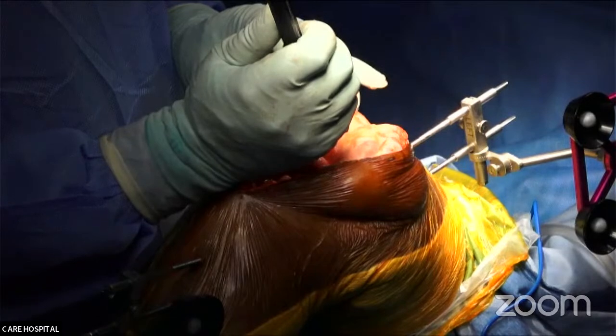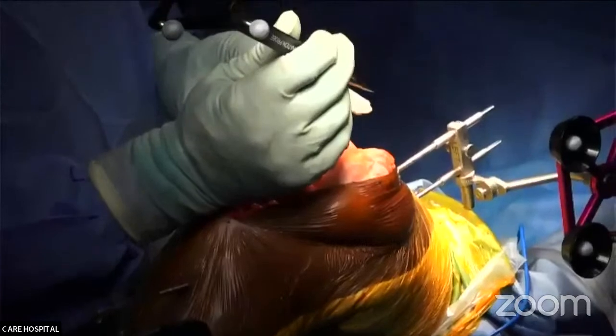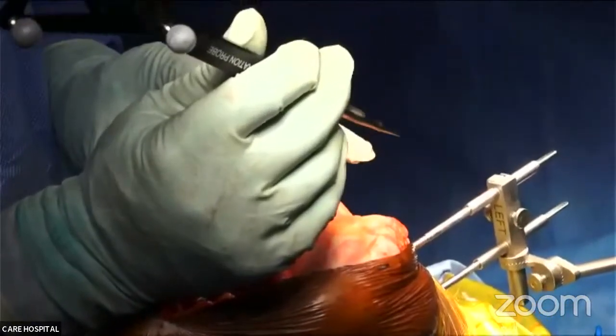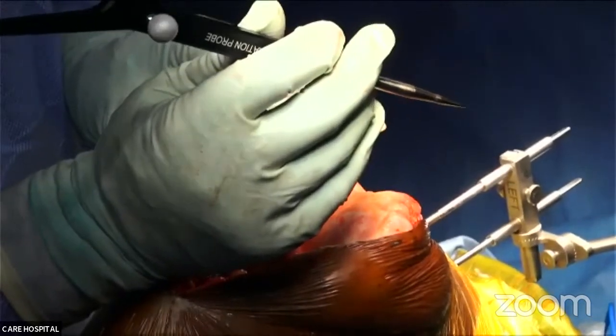So, Dr. Santosh, we are waiting for a bit because I feel that these points are not correct. The defect is on the medial side, whereas it is showing proximal medial on the opposite side. So we'll just check with the laptop.